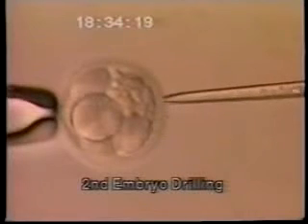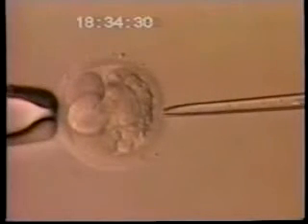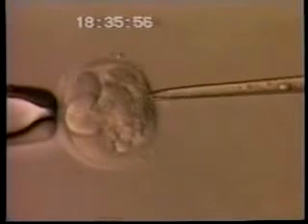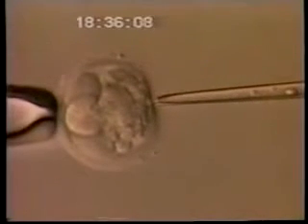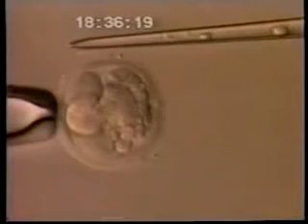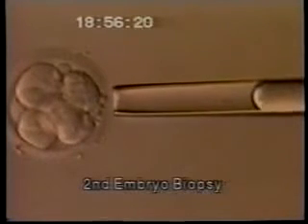Now you'll notice a second embryo in which there is more fragmentation that is obscuring your view of all of the 8 cells. We're going to make our hole in the outer shell, that is the zona pellucida, right over this area of fragmentation. The fragmentation is just cellular material that can never result in any baby. And that is why, if we have a choice, we try to make the hole right over that fragmented material so that there's no chance we'll damage any of the true blastomeres of this embryo. Once we make the hole, we can remove those fragments so as to get a better view of the embryo, but more importantly, we can actually remove, once again, 2 out of 8 cells so that we can test whether or not this embryo can genetically result in a viable baby without severe lethal disease.